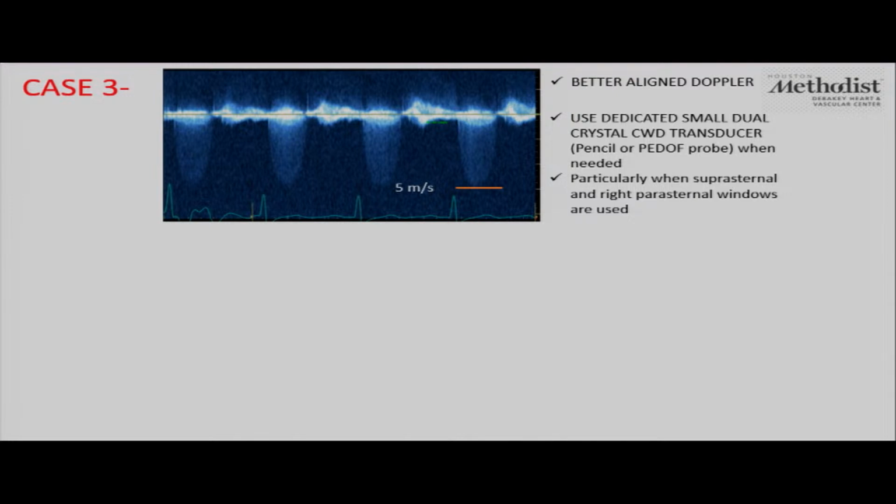And also for all the sonographers in the room, I'm sure you all use the dedicated small dual crystal or PDOF probe to make sure that we are getting the peak velocities right, especially when you're using the right parasternal or the suprasternal windows.